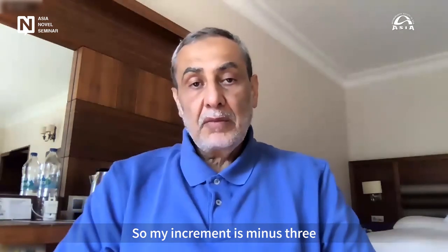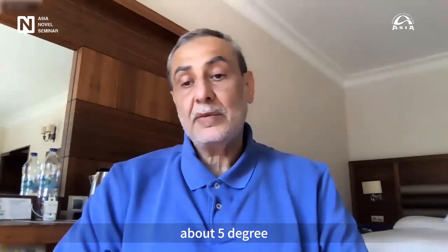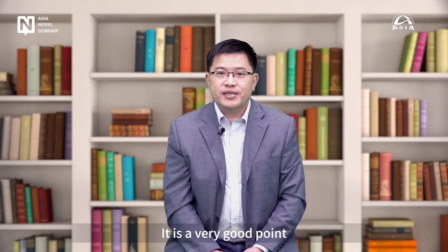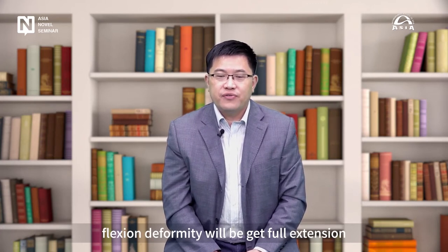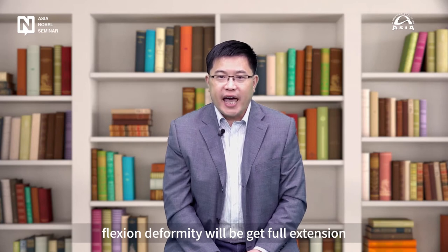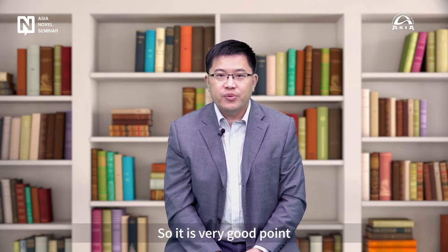So my increment is -3. In other words, I want them to be hyperextended about 5 degrees. It's a very good point. The first step to get rid of recurrence of flexion deformity will be to get full extension or maybe even hyperextension on the table. So it's a very good point.